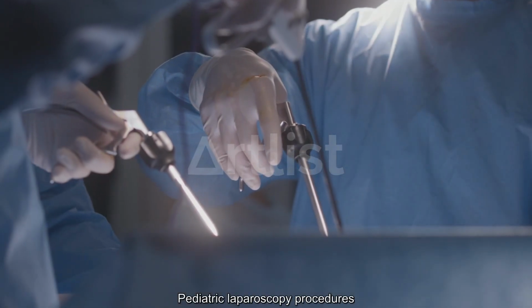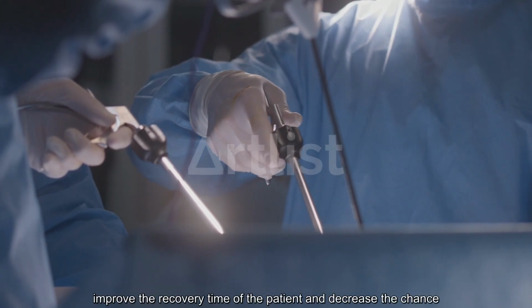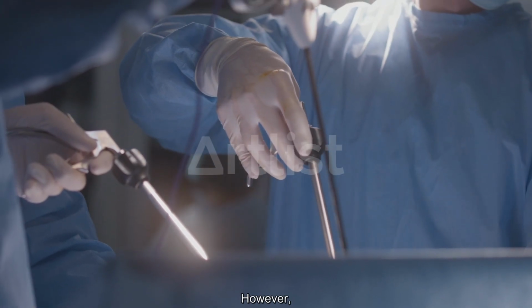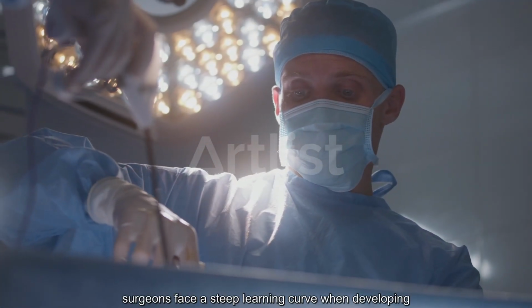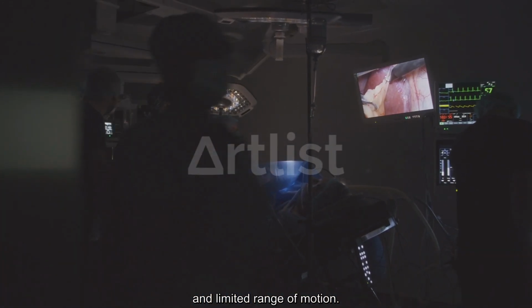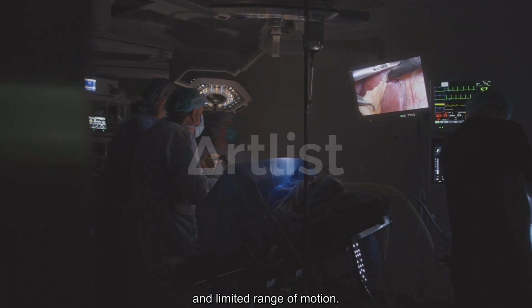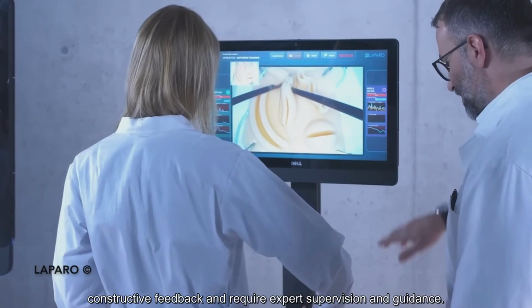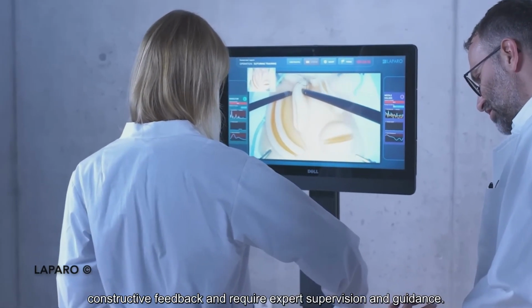Pediatric laparoscopy procedures improve the recovery time of the patient and decrease the chance of post-surgery complications. However, surgeons face a steep learning curve when developing their laparoscopic skills, working in a confined 3D environment with a 2D view and limited range of motion. In addition, current simulators often lack constructive feedback and require expert supervision and guidance.